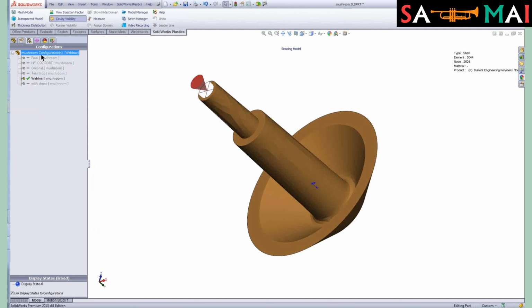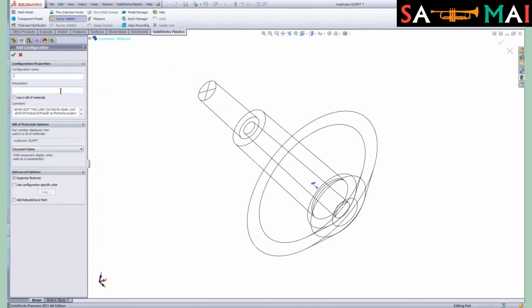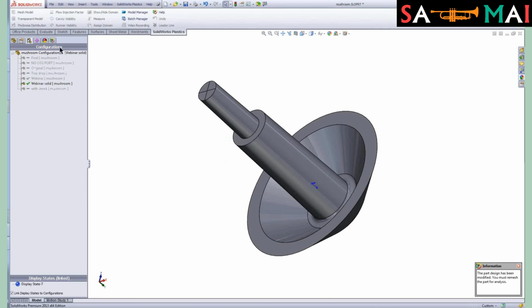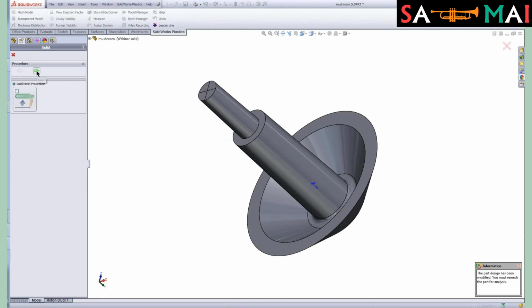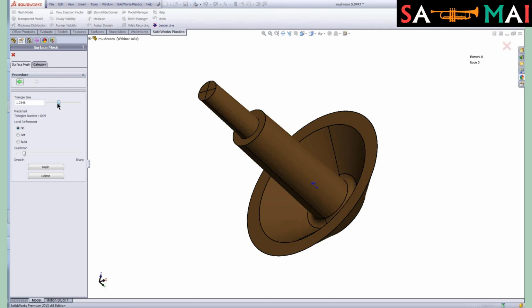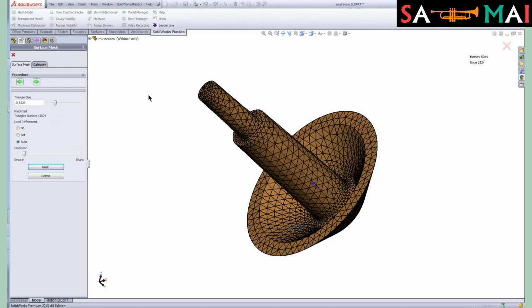So let me add another configuration here, and we'll do this one. We'll call it webinar solid mesh. And yes, we're going to start a new project. Here, what I'm going to do, go into my settings. Solid mesh, rather than just meshing the surface of the part, is actually going to mesh the entire volume. As you can see here, if I had cavities plus inserts, this is where I would define it in plastics. And I'll go back to the simulation settings for this that I had before.